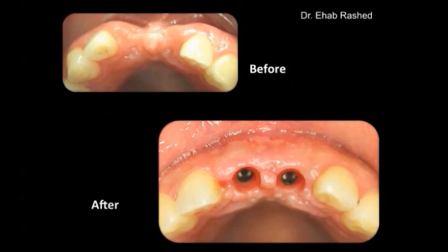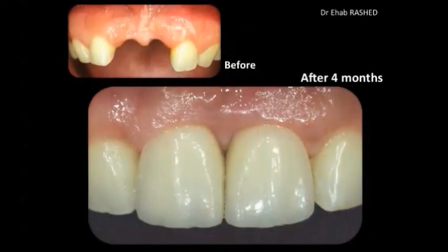the first steps, we have to diagnose properly, check the gum, check the bone, study the case, take some pictures, look at the case, and then go through the diagnostic steps that we discussed before. How much bone we have, how much gum we have, how much distance we have between the adjacent teeth, and how many millimeters of diameter implant we should use. And by implementing all the things and following these guidelines, you can always reach this kind of result. And this is how we started at the top, and this is how we finished at the bottom.